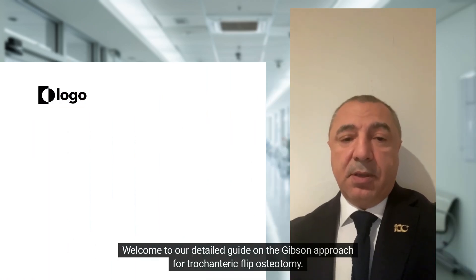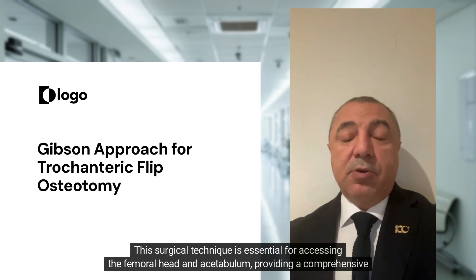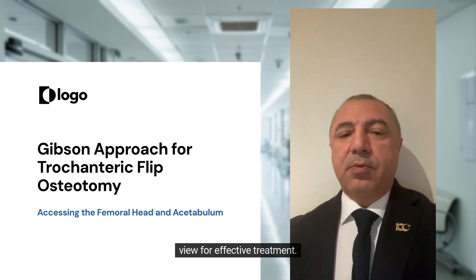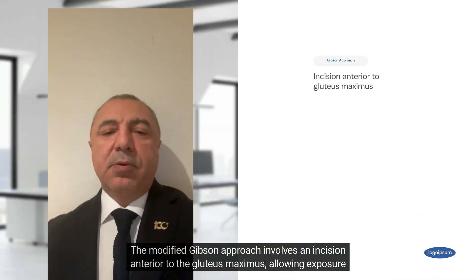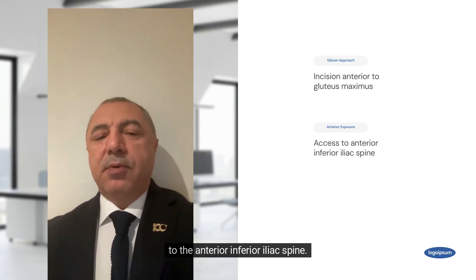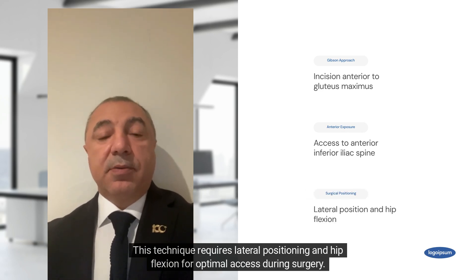Welcome to our detailed guide on the Gibson approach for trochanteric flip osteotomy. This surgical technique is essential for accessing the femoral head and acetabulum, providing a comprehensive view for effective treatment. The modified Gibson approach involves an incision anterior to the gluteus maximus, allowing exposure to the anterior inferior iliac spine. This technique requires lateral positioning and hip flexion for optimal access during surgery.